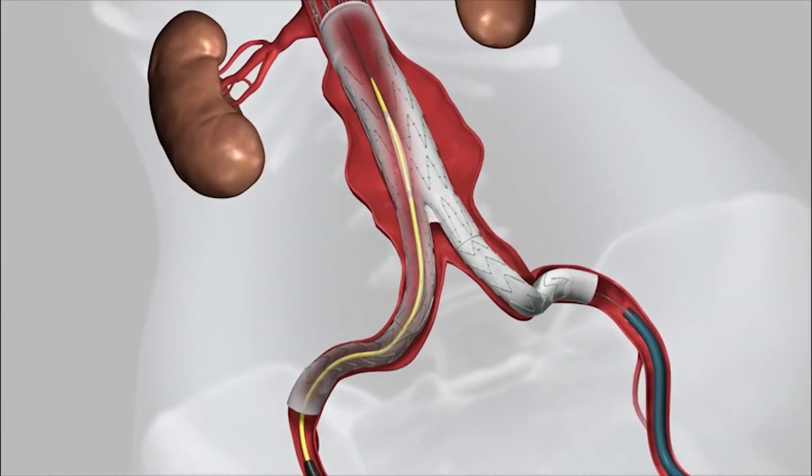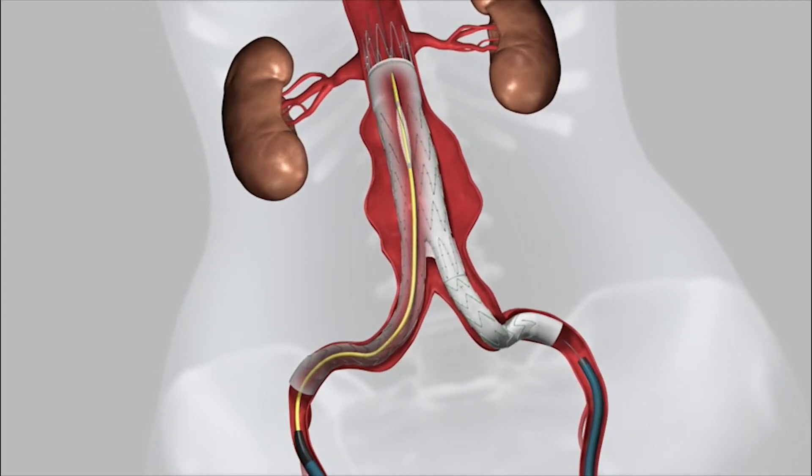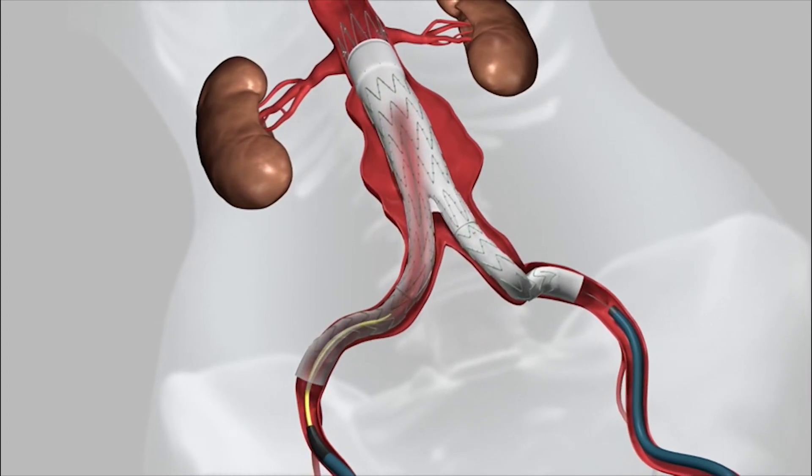The yellow catheter you see is a balloon that we use to make sure the device is against the aortic wall without any folds or kinks. First, the main device is ballooned, then the left and right limbs.